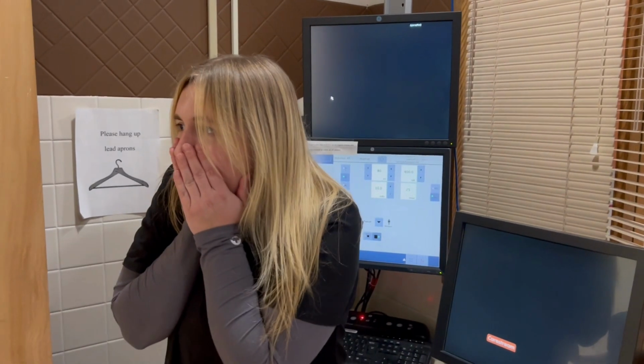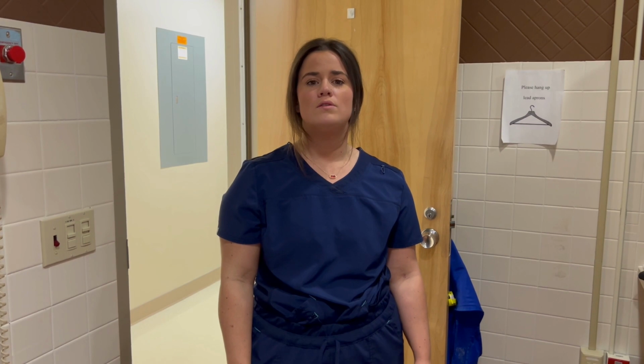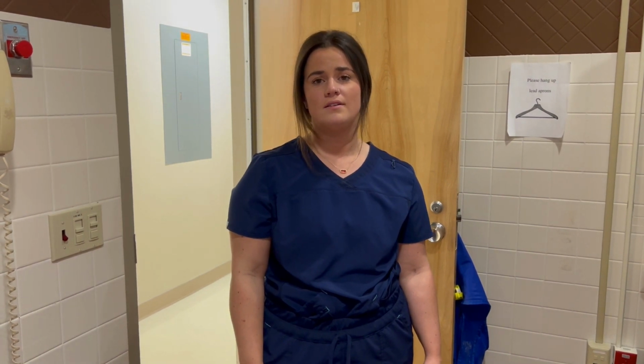Freeze! There are two mistakes that the tech made during this exam. When you are x-raying a patient, your main goal is to use the shortest exposure time possible. This means that the technologist should have set the correct technique before they positioned the patient or checked if the patient moved after setting the technique. This mistake not only increases the exposure time, but the amount of radiation given to the patient due to the technologist having to take a repeat image. The technologist also uses the wrong technique for their patient. When dealing with pediatric patients, it's the technologist's job to make sure they correctly decrease the technique for their patient. Now let's watch that back and watch the tech do it right.